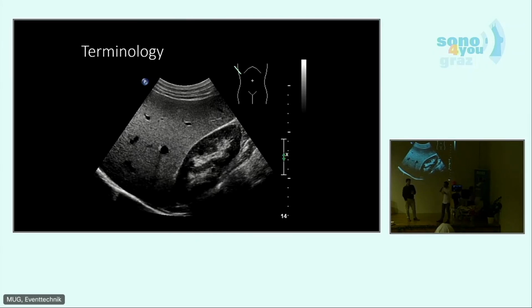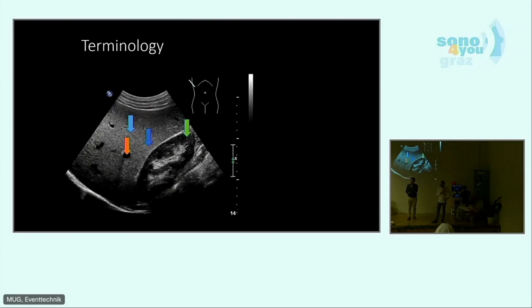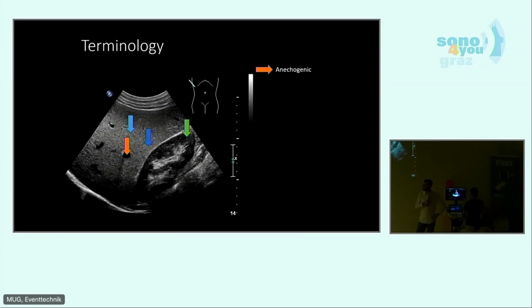At that point of our presentation, looking at this picture, I would say it looks like the weather report for Graz in November, just everything grayish. Okay, I have to give you that one, but that is why we want to introduce some terms. And we put arrows here. We will start with the orange one. As you can see, it's a black structure, which means we do not get any echo from this one, which is why we call it anechogenic.